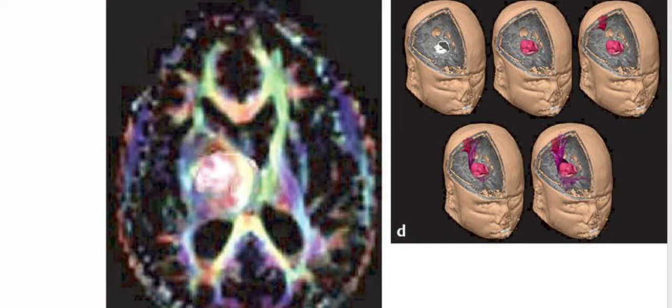So the diagnosis here is that there is a preoperative tractography done here, and tractography is basically functional mapping of the tracts and fibers and interconnections within the brain. And this is shown here, that is, preoperative tractography is shown here.